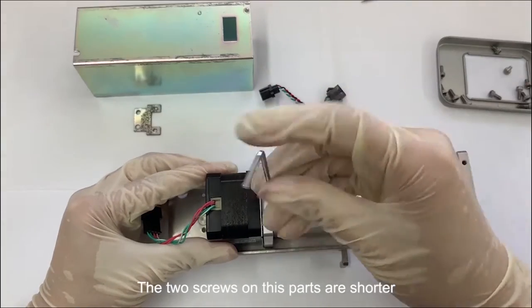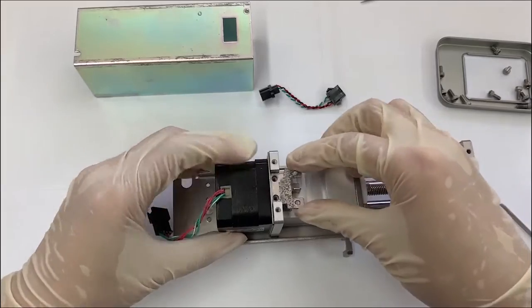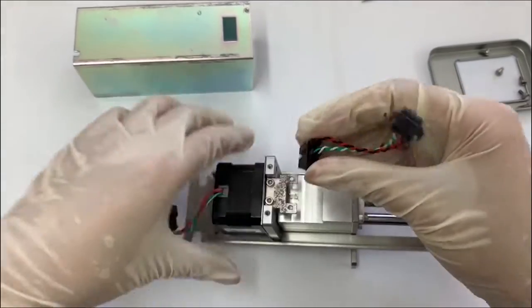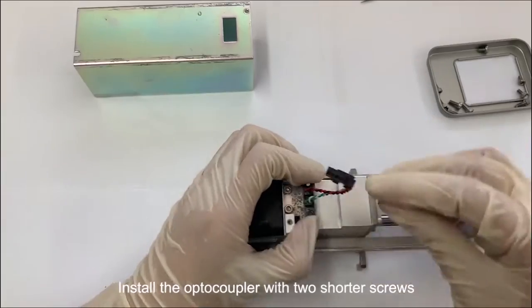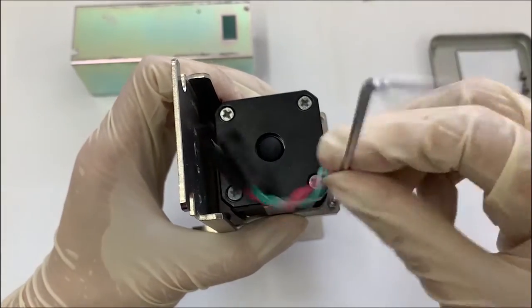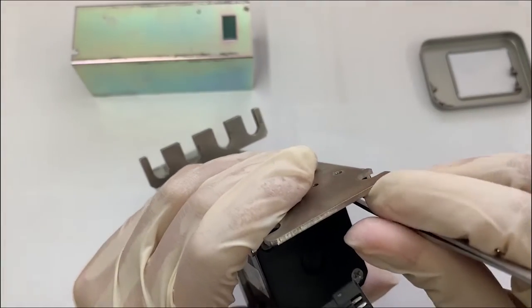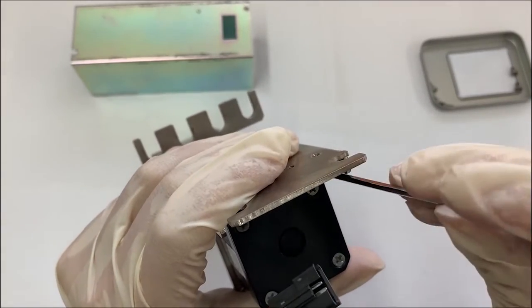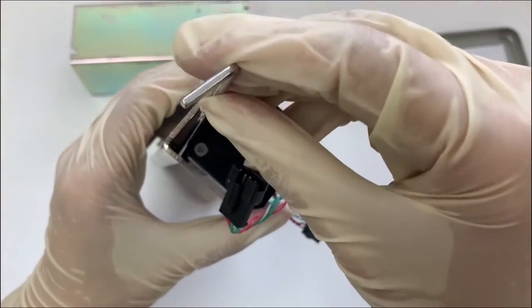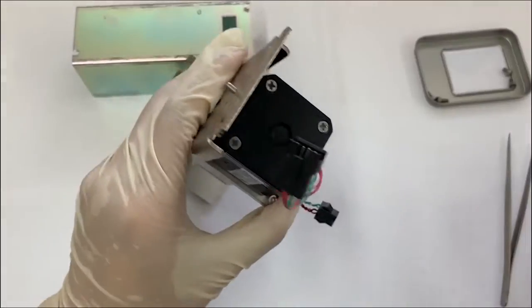The 2 screws on this part are shorter. Install the optocoupler with 2 shorter screws. Install the 8 screws.